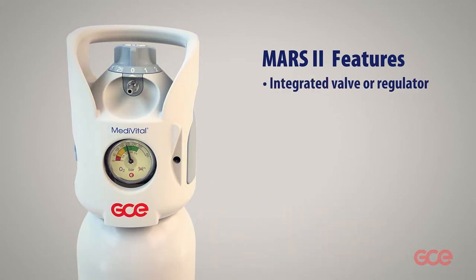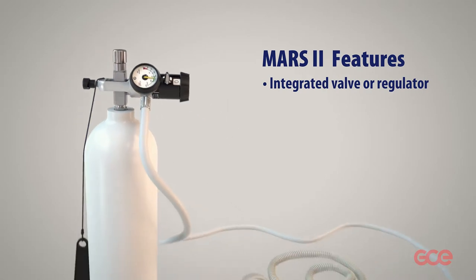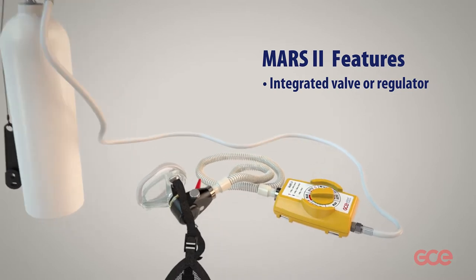Mars 2 can be used in two different configurations: integrated valve or regulator with a region gas specific quick connector. The recommended program can be chosen by turning the switch.